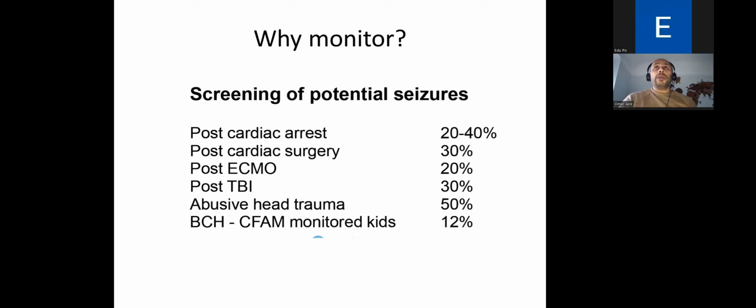But certainly in the UK, for example, mortality from PICU on average is what, 2 to 3%. Mortality from cardiac surgery is typically 1 to 2%. Okay, that's mortality. But if you look at neurological morbidity, i.e. the neurological sequelae of either PICU or cardiac surgery, that's huge. And so we need to be better in terms of multimodal monitoring of neurological status of our patients, because that might then provide some information about preventing long-term neurological sequelae or neurological injury. And so, again, CFAM is one component of that in the bigger picture.